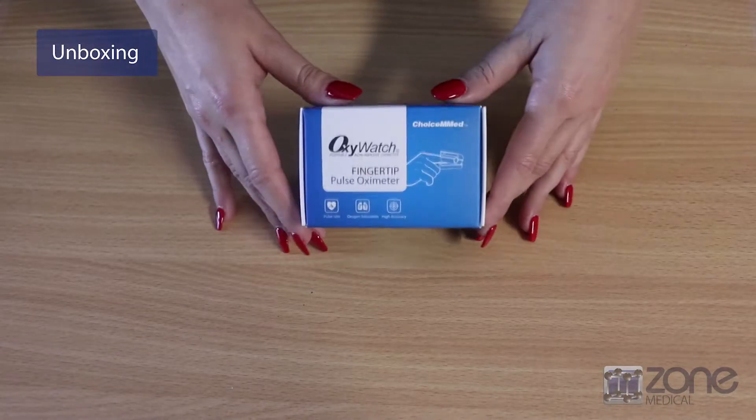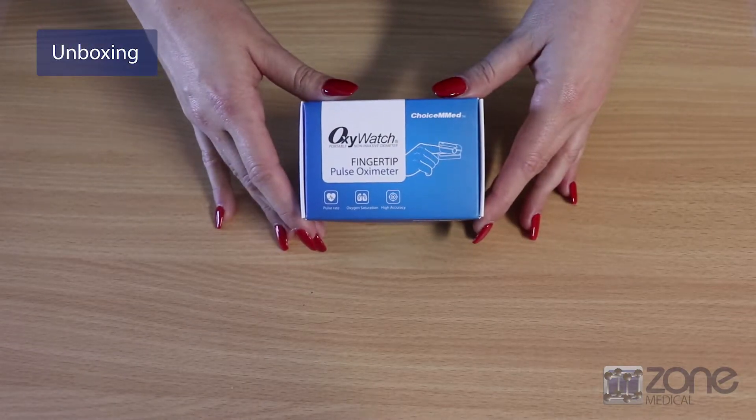This is the new fingertip pulse oximeter by ChoiceMed. It is the CN310.